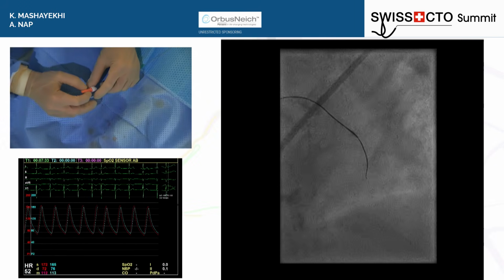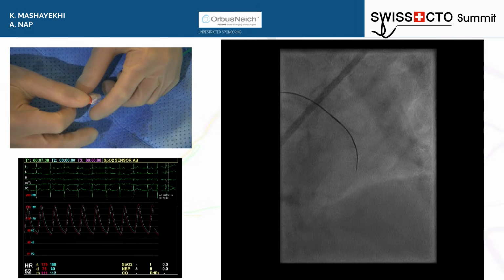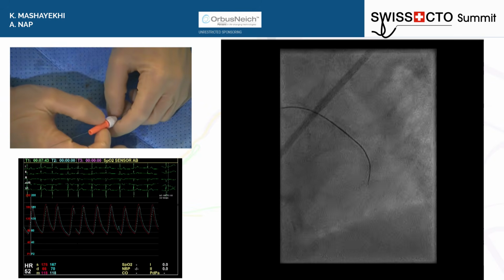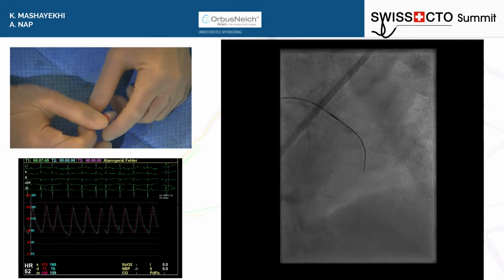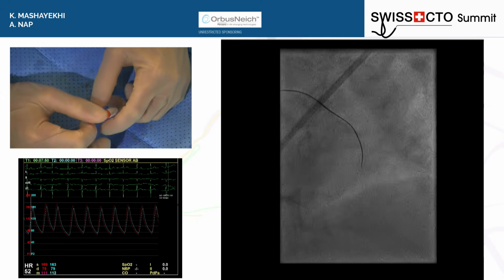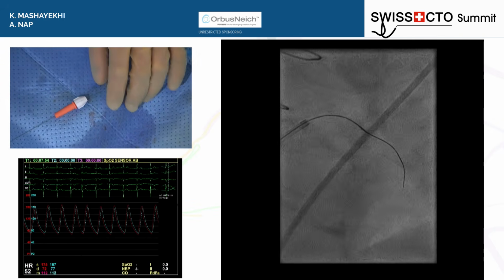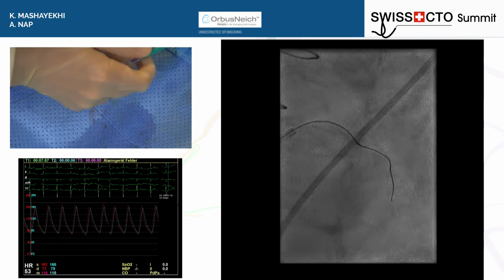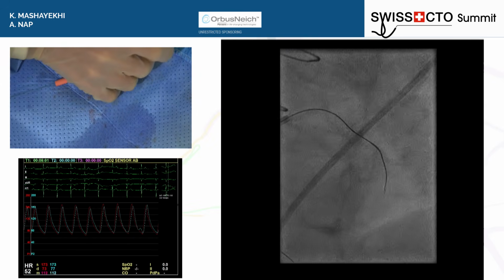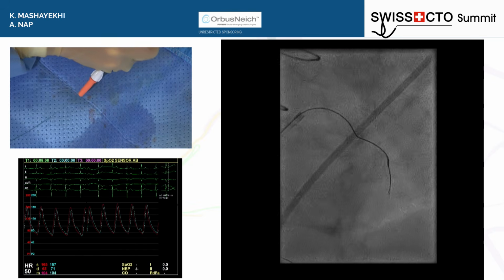Gambis is very gently maneuvering the wire in an antegrade fashion there. And what is your tactile feedback here? Is it hard? There is a lot of resistance. Can you see the microcatheter going back when I want to bring the wire forward? So maybe you can screw in the proximal cap. Nice maneuver. You got enough grip in the lesion to get it in, probably.